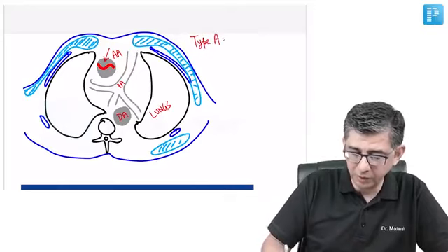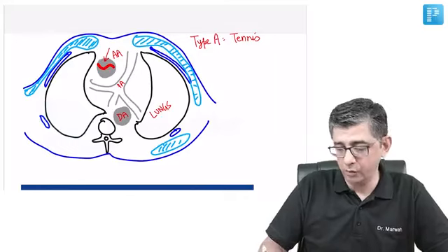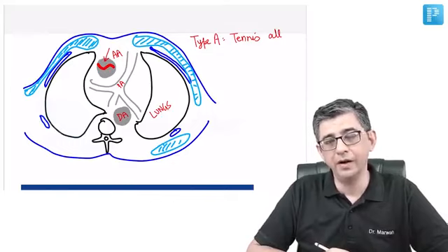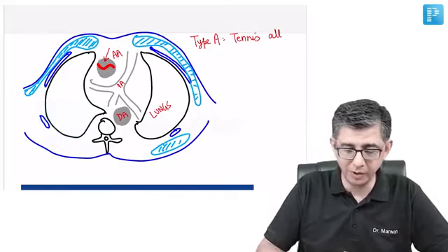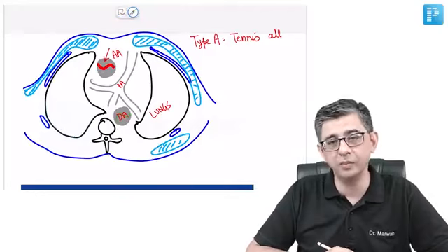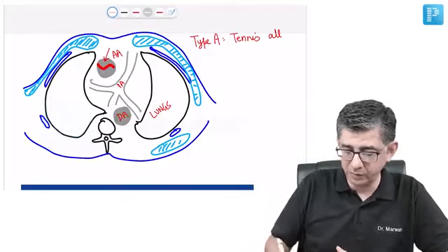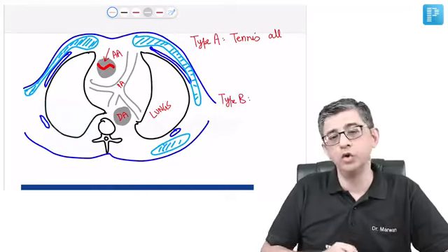The logic to be simply used here is that if you find this kind of an intimal tear which gives the configuration to the aorta as that of a tennis ball, then anteriorly present it is type A aortic dissection. Suppose hypothetically, if the same kind of an intimal tear or flap was visualized in the descending aorta of the patient, then you will answer as type B aortic dissection. Now, why that is important from the exam perspective is because in type A aortic dissection, you always have to go in for surgery.